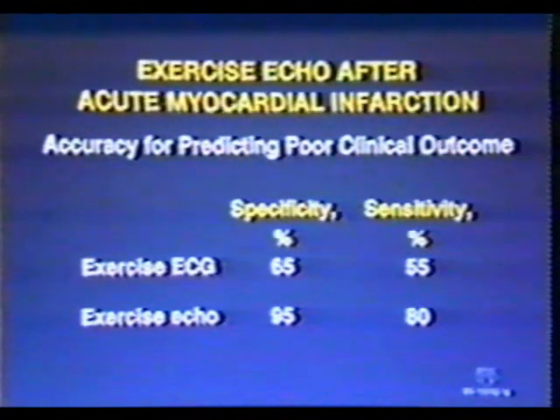Therefore, exercise echocardiography had significantly higher specificity and sensitivity than the exercise ECG for predicting adverse clinical events for patients recovering from acute myocardial infarction.